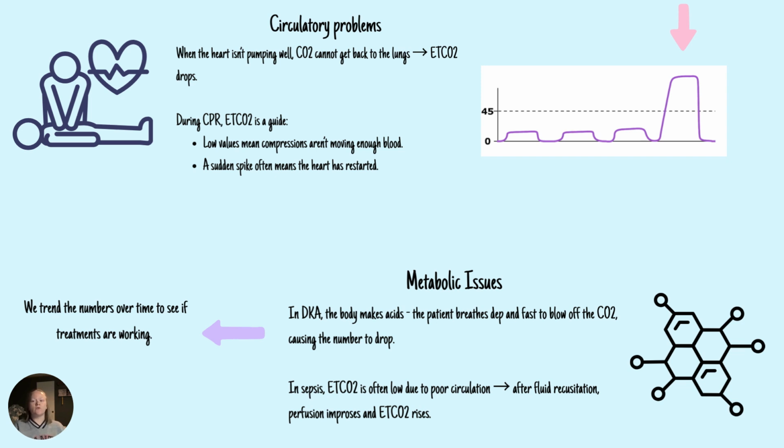Capnography gives us a window into a patient's perfusion status and not just their breathing. This is why it's super valuable during resuscitation efforts.